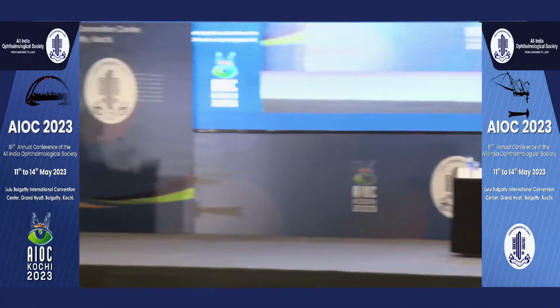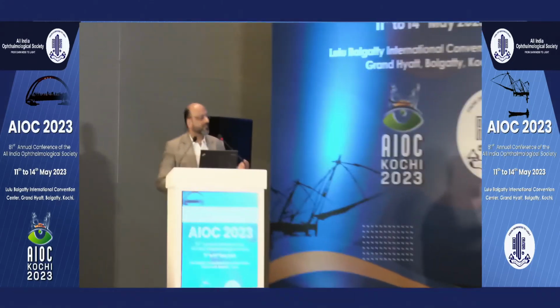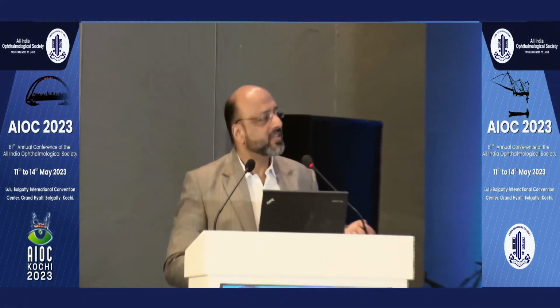That's a good question. If it's a cataract, I think you could use the side ports. But if you have a good 30 gauge needle, if you're injecting gas, I would suggest using a 30 gauge needle because there's no fish egging. Just a hack: if you've got multiple bubbles, just use a bud and tap the sclera. Usually it coalesces into a single bubble.